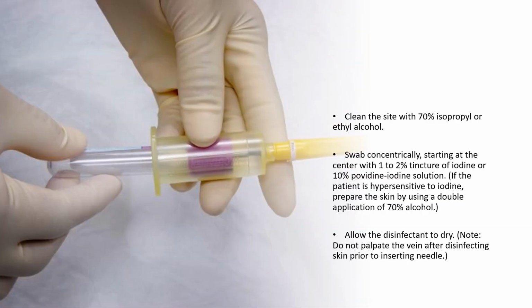Clean the site with 70% isopropyl or ethyl alcohol. Swab concentrically, starting at the center, with 1 to 2% tincture of iodine or 10% povidone iodine solution. If the patient is hypersensitive to iodine, prepare the skin by using a double application of 70% alcohol. Allow the disinfectant to dry. Do not palpate the vein after disinfecting the skin prior to inserting.